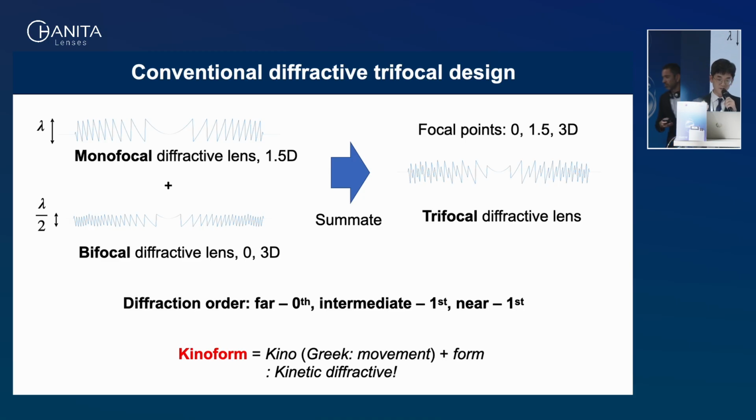And if you see this wavy sawtooth profile, definitely these are what we call kinoform, which means in Greek the movement and the form. So this also shows that this is a wavy movement diffractive design.